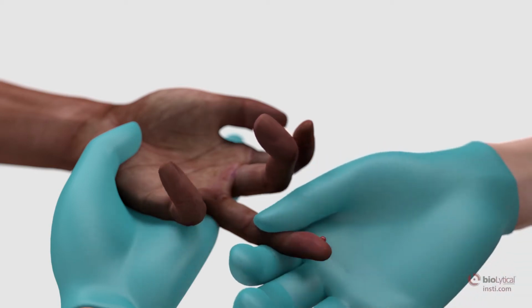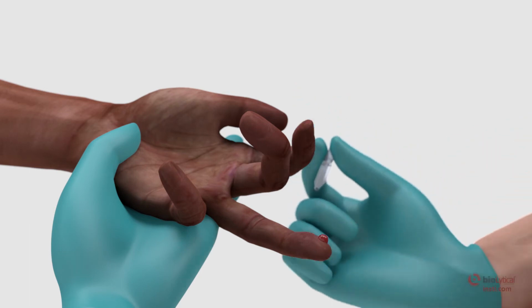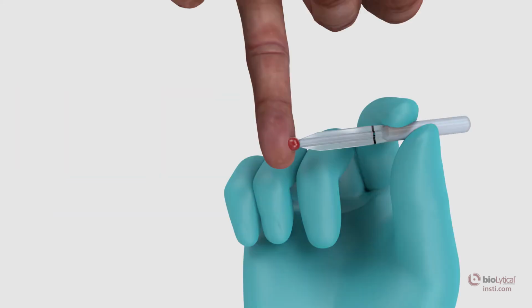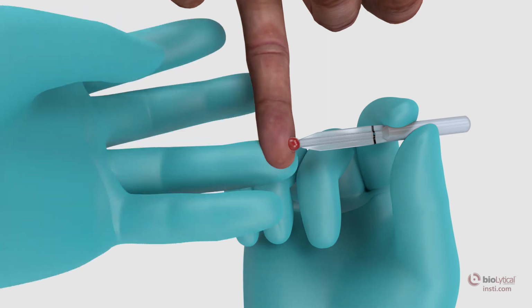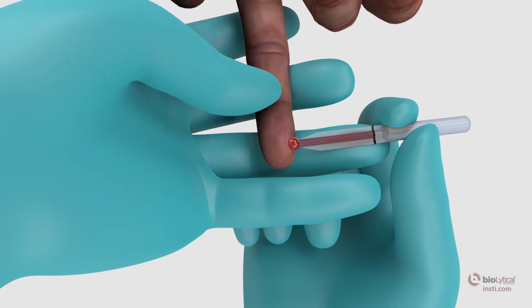Lightly squeeze the finger in one motion towards the tip to release a bead of blood. Filling of the capillary pipette is automatic. Do not squeeze the bulb while sampling. Maintain this position until the flow of the sample has reached the fill line and stopped. With INSTI, the first drop of blood does not need to be wiped. Hold the pipette horizontally and carefully touch the tip of the pipette to the large round bead of blood. Hold horizontally and gently, being mindful not to cover the pin-sized hole on the 50 microliters fill line.